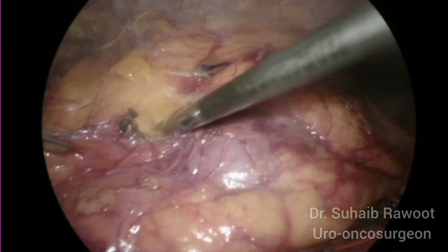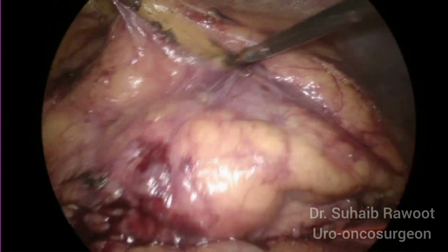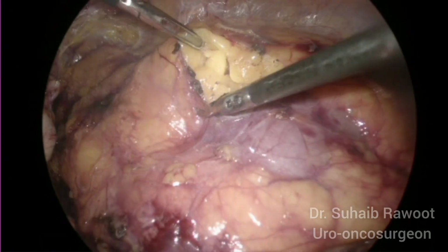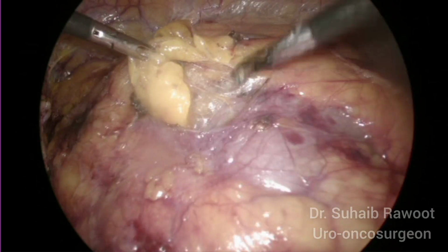Now we are opening the Gerota's fascia to find the renal tumor. So how much you need to open or how much you need to flip the kidney actually depends upon the location of the tumor. If the tumor is lateral, you don't need to flip the entire kidney, but if it is posterior, then you need to flip the entire kidney.